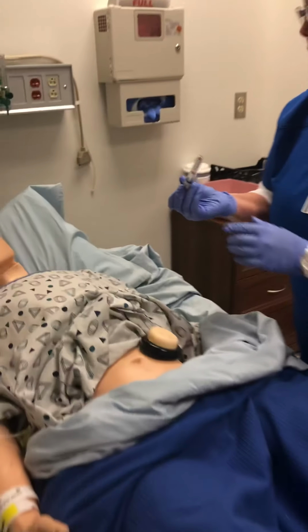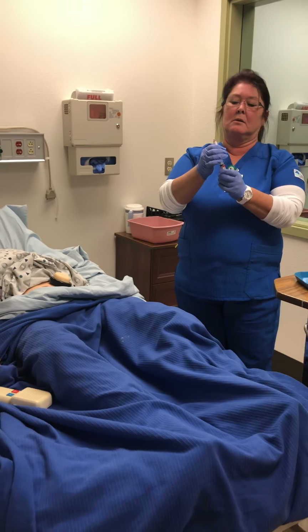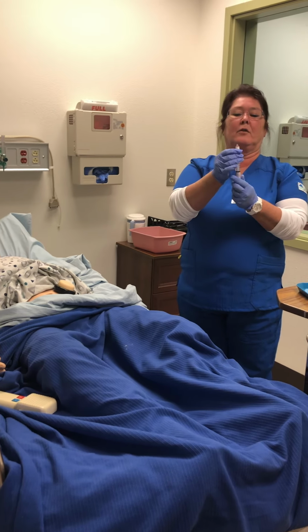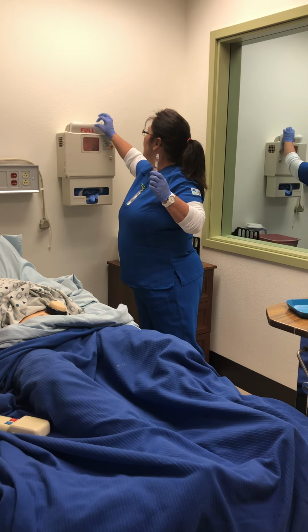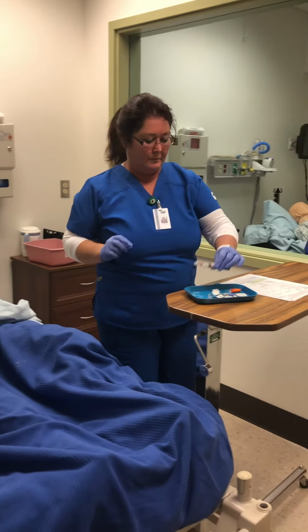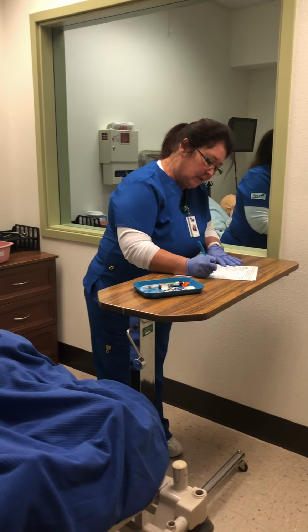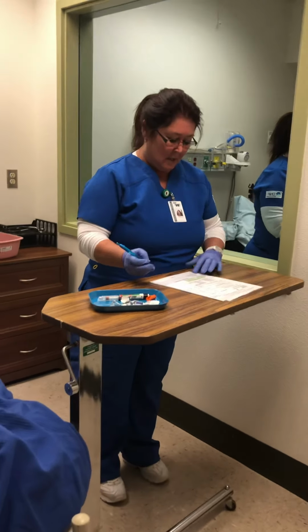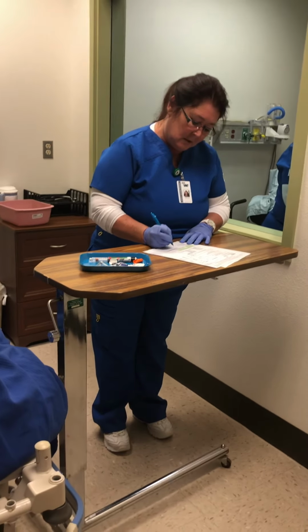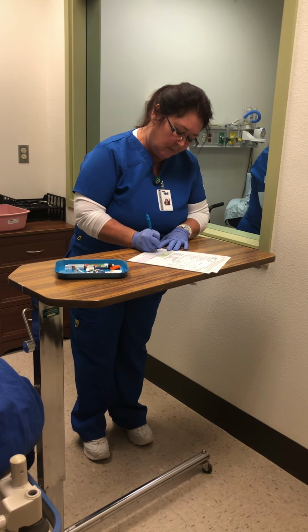Perfect. Good job, Shirley. So I'm now going to remove the needle, which already has the protection over it. And we're going to put that in the sharps container. And I'm now going to initial that I had given her 2 units. I am going to sign and initial down here.